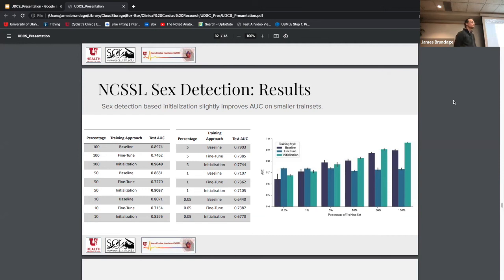Yeah. One question for this ejection fraction. You phrased it as a binary classification task. Is there a reason that you chose that rather than a regression? Yeah, truthfully, I tried to mimic what had been done previously, just for the sake of wanting to have a really good baseline and comparison for these experiments. Now, in practice, I tried this as a regression problem and it did really poorly. And I don't know why.